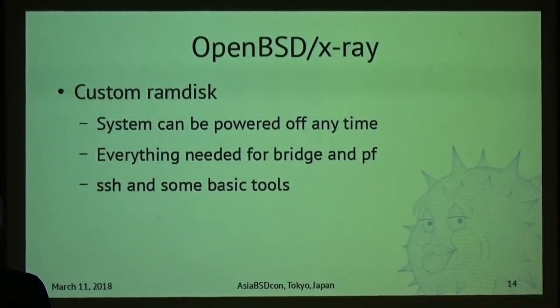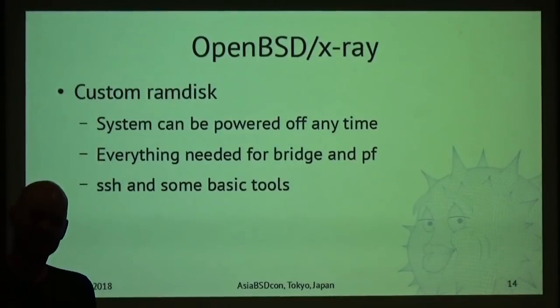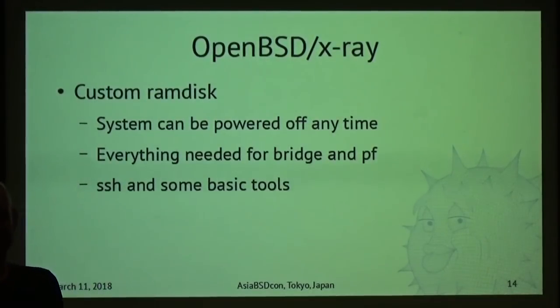So a machine that has not properly shut down doesn't come up, even if you just have to enter something like, yes, I want to run fsck, or whatever, it is not going to happen. If the machine doesn't work the way it's supposed to, it's going to be exchanged, and that's going to be pretty costly. So in the end, they don't really have a choice but to use a RAM disk that kind of works all the time.